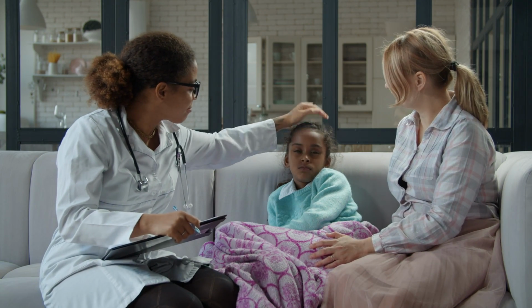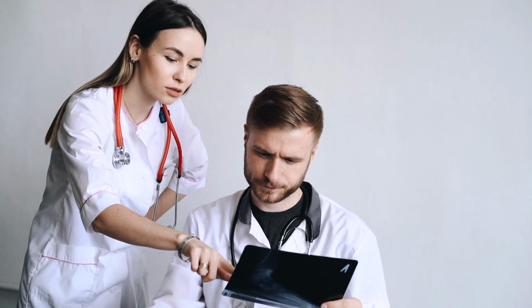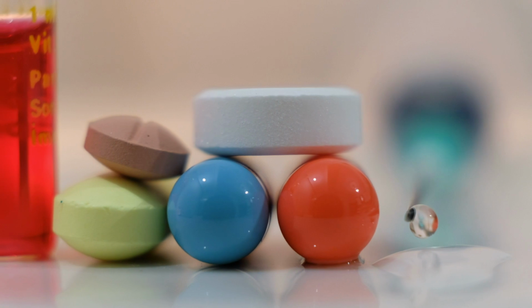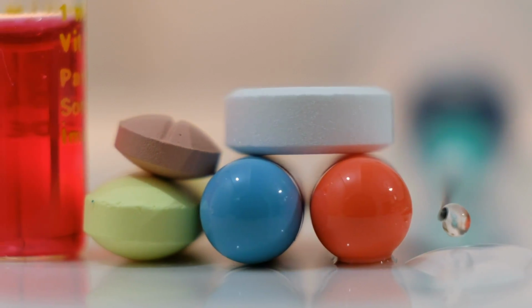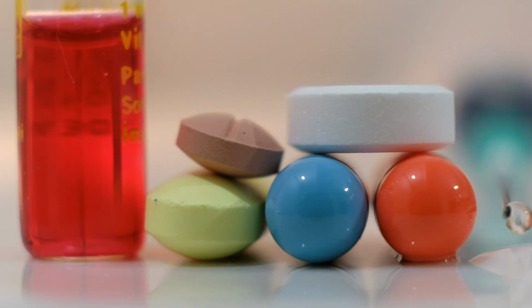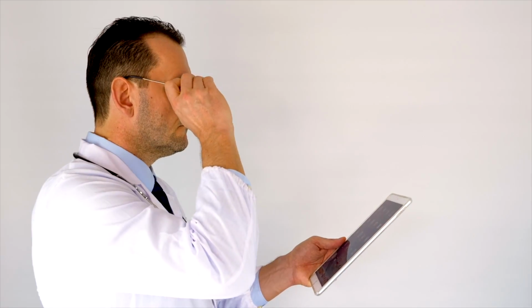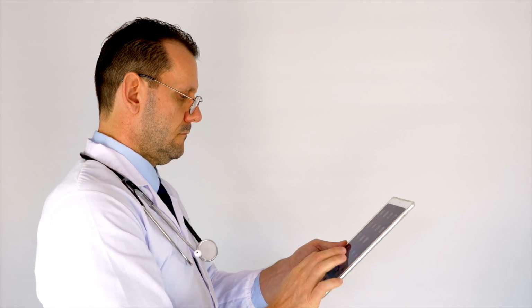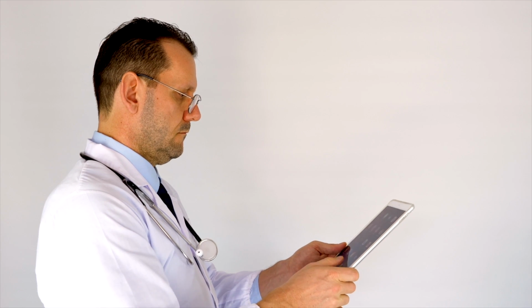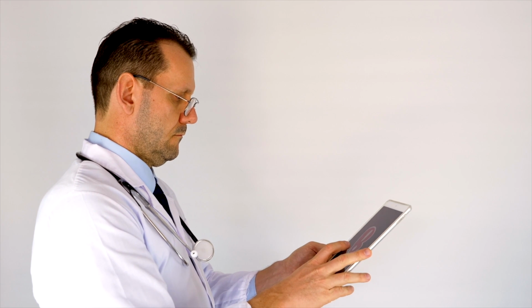Because the stethoscope can't accurately reconstruct the input acoustic signals every time, doctors have a 40% chance to misdiagnose the patient. And also, if anyone's ever worn a stethoscope and tapped on the diaphragm, you would know that it would generate a super loud sound. Doctors do that accidentally as well, and since they use stethoscopes on a daily basis, they often receive permanent hearing loss. And finally, because mechanical stethoscopes can't record data, doctors don't have data to reference and might be inconsistent in subsequent diagnoses. So to address these problems, we considered the following.